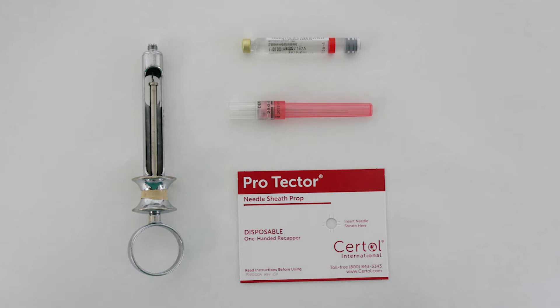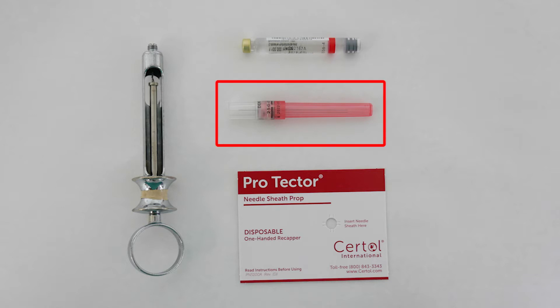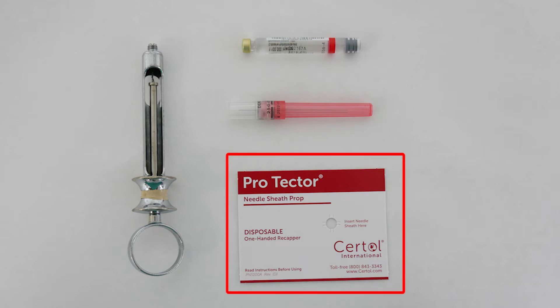The materials we will need today include a syringe, anesthetic cartridge, long needle, and recapping card.